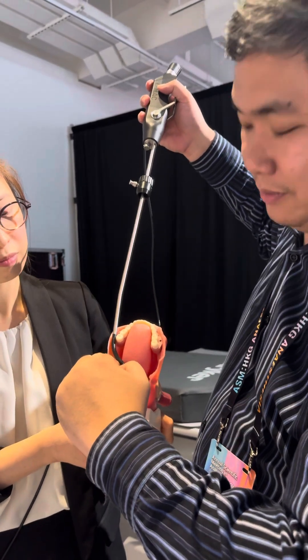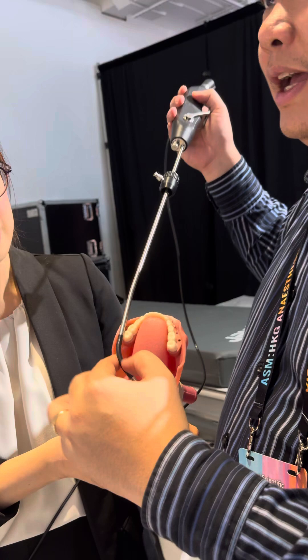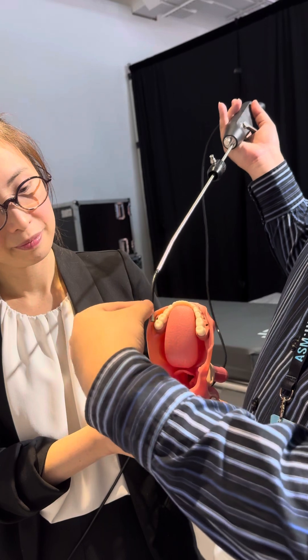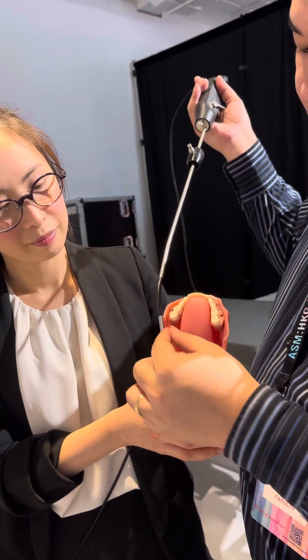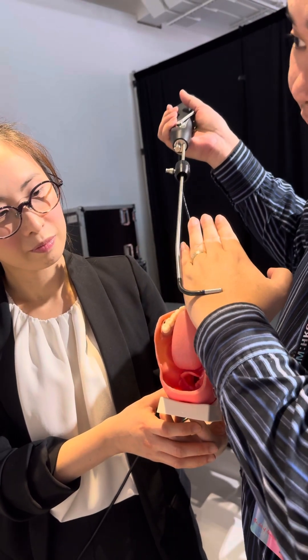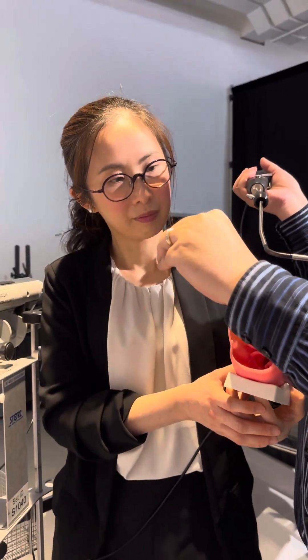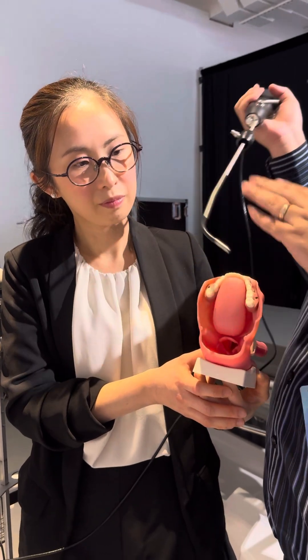And then push down — it's safer. Another reason is that the patient will have saliva. If the tube is oriented like that when you push, the opening faces this way, so you could be scraping the saliva. Unlike when I push like this — the opening is on the side, so the saliva doesn't go through the camera or inside the tube.